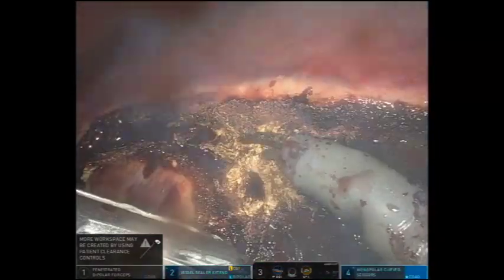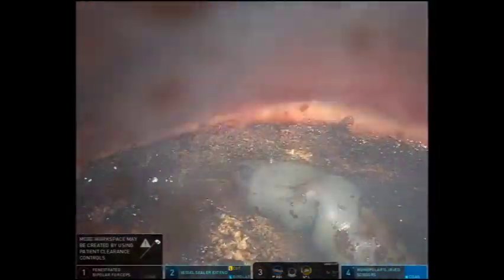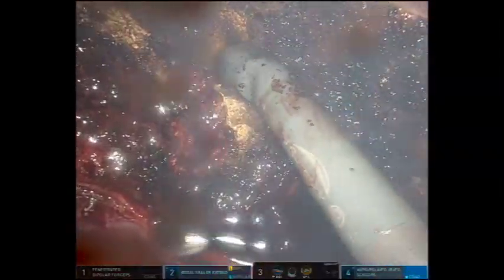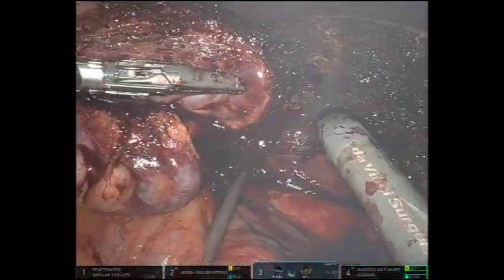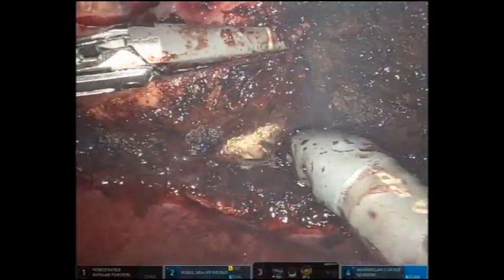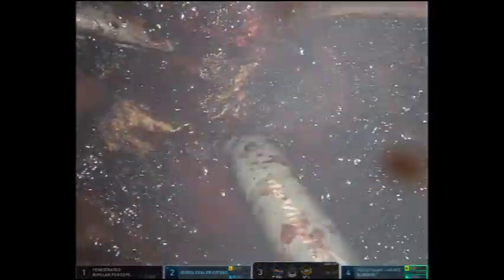The vessel sealer is used to seal larger vessels. Advanced insufflation with smoke evacuation is utilized to clear the smoke created by cauterizing the liver parenchyma. Traction is maintained on the specimen so that the deepest portion can be transected.